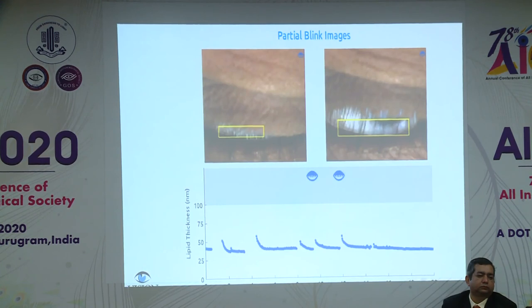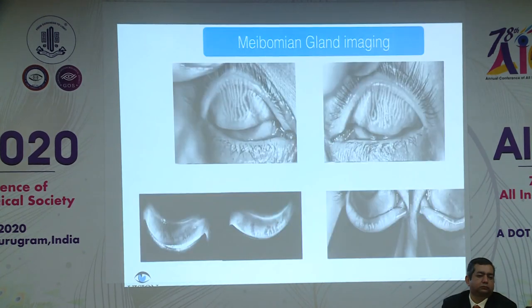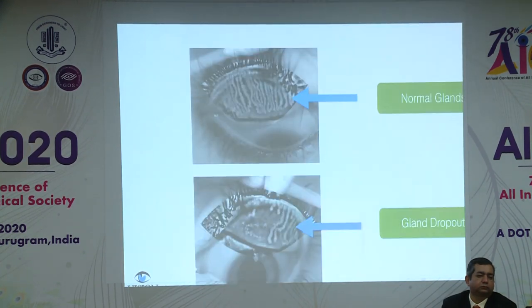It also gives you these partial blink images, and you get these meibomian gland images. So when you have somebody like the individual on top having healthy looking meibomian glands, whereas what you have below is somebody with a lot of gland dropout. So that is somebody with probably long-standing meibomian gland dysfunction.